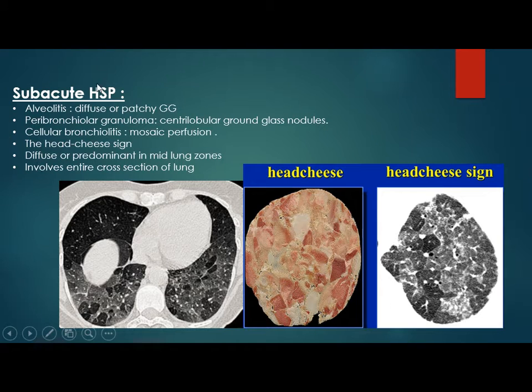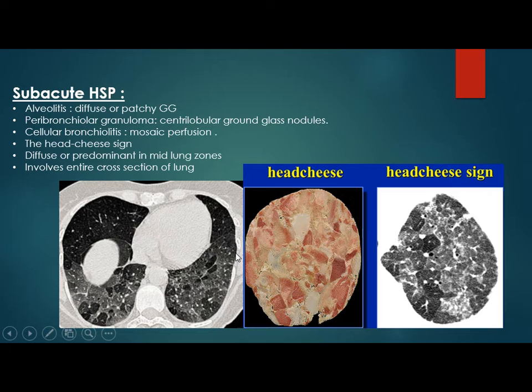The head cheese sign is characteristic for the subacute type — a combination of mosaic perfusion, air trapping, and normal lung with ground glass appearance. This disease is diffuse or predominantly in the mid-lung zones and involves the entire cross-section of the lung, not just peripheral or central. Surprisingly, it is more prominent in the lower lobes here. The expiratory film accentuates air trapping and mosaic pattern, and it looks like a crazy paving pattern.